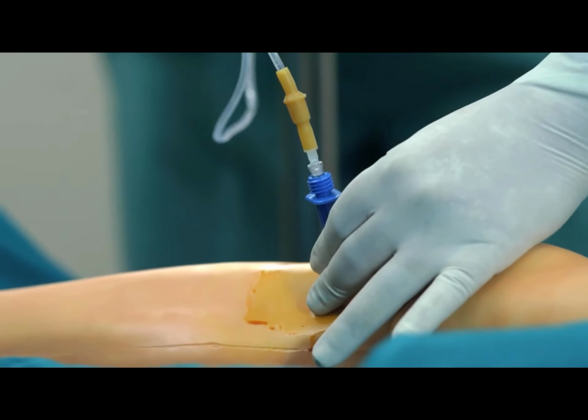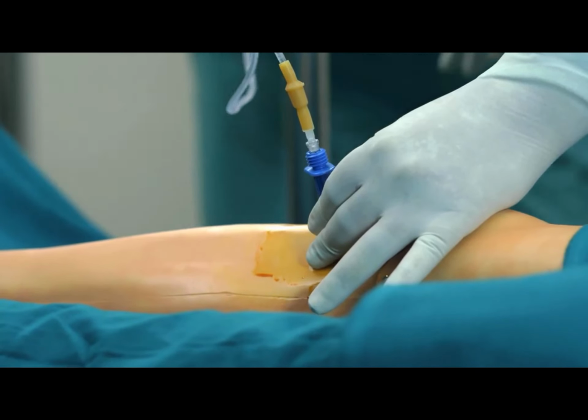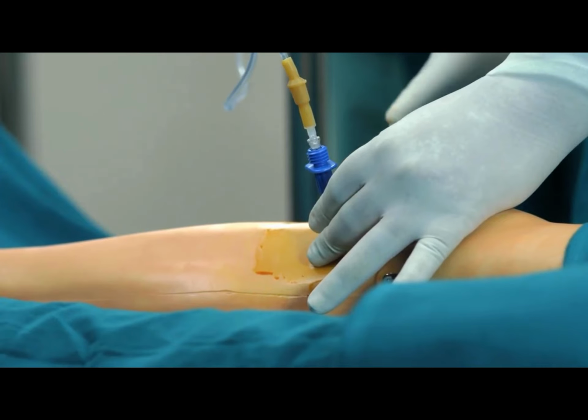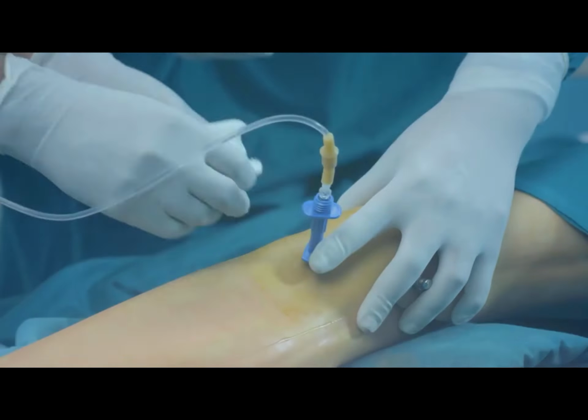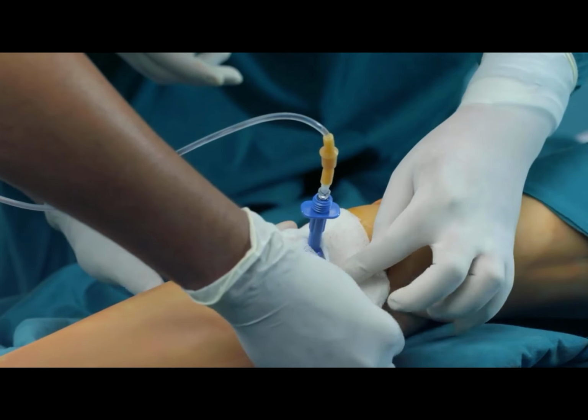If the fluid does not flow easily, reposition the needle by pulling back slightly. But if resistance is still encountered, the needle should be removed and a new site has to be selected. Secure the needle with the bulky gauze dressing and micropore tape.